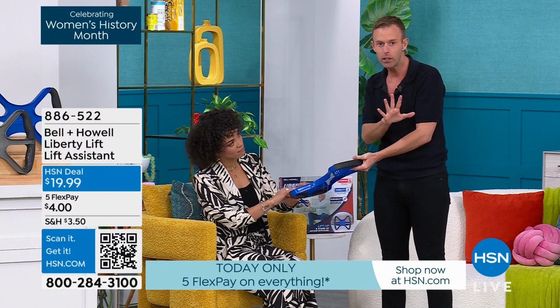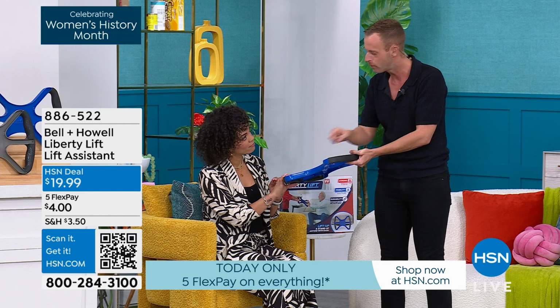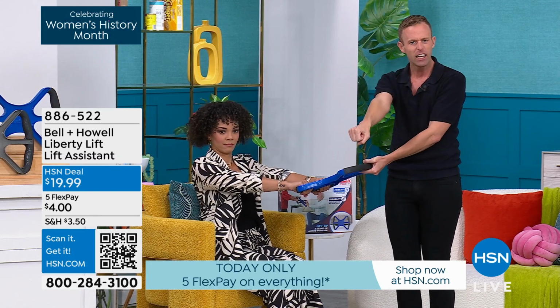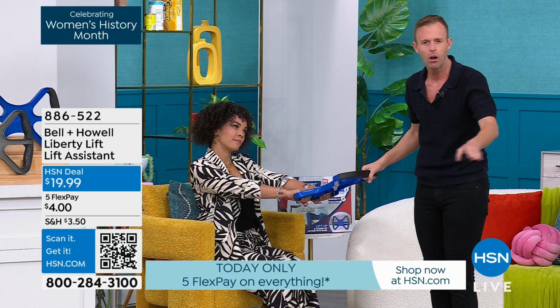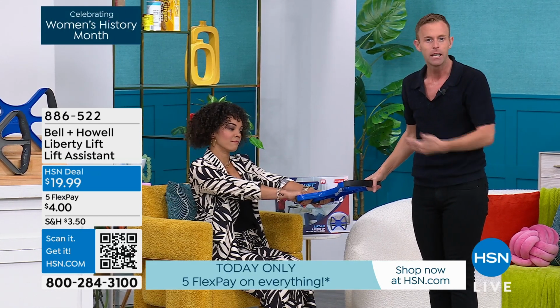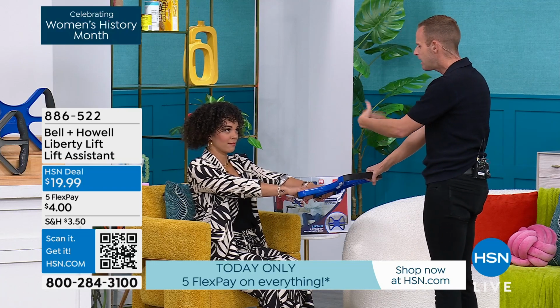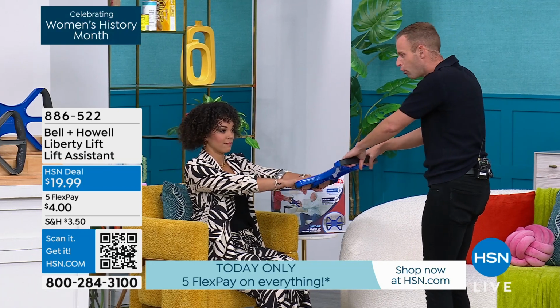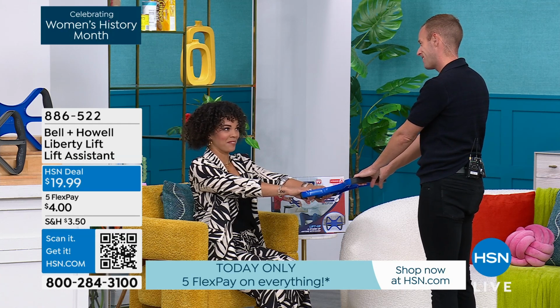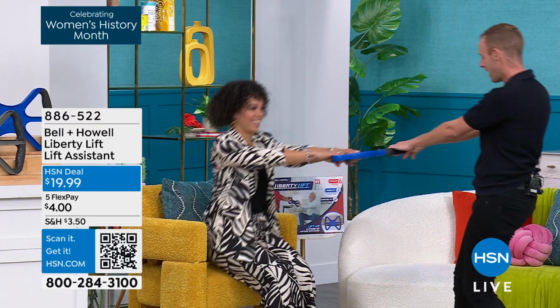And so when you get it home, eventually you will find your own groove. But I want you to do this. Nicole's arms will be completely straight, just locking her elbows, so there's no give at all, because Nicole could be 500 pounds, it's not going to matter to get her up off the couch. Same thing with me, I'm locking my arms, not because it's hard to pull, but I just don't want anybody to use any strength at all. I'm going to give you a countdown. Okay. I think you're going to be surprised. 3, 2, 1, I take a step back.